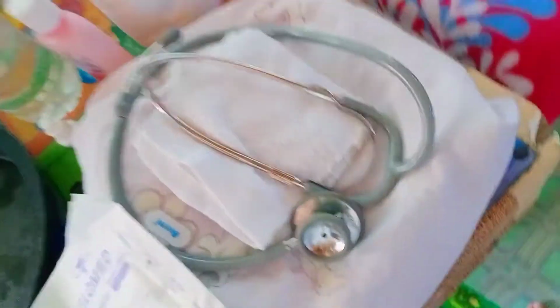Enema is inserting liquid or gas into the rectum, which is the lower part of the large intestine. Enema can be effective in treating certain medical conditions, but regular enema can be a serious health problem. So this is all my equipment that I ordered to use.